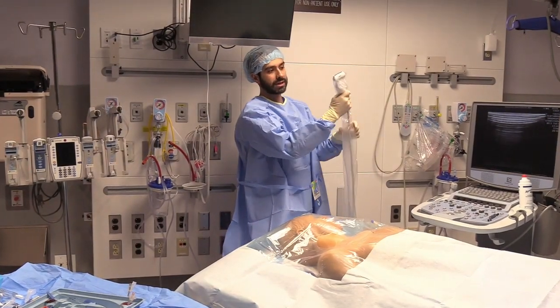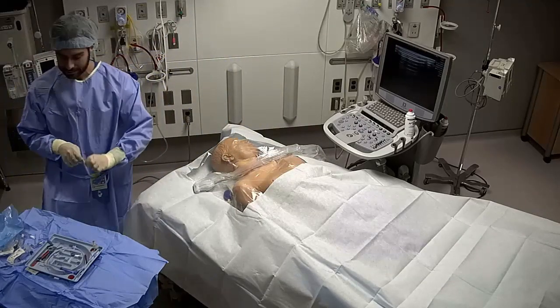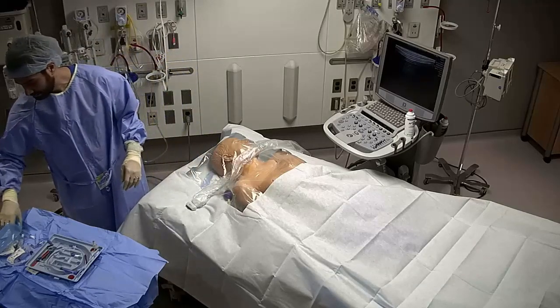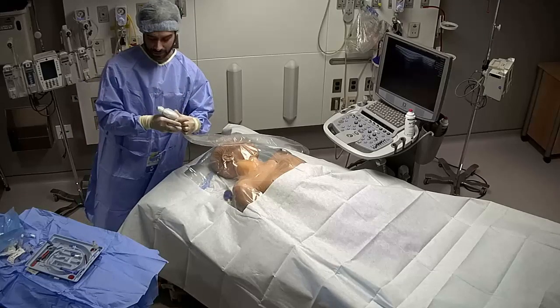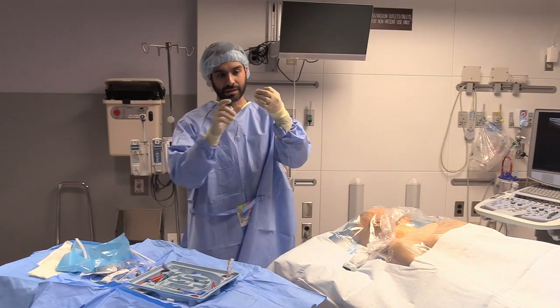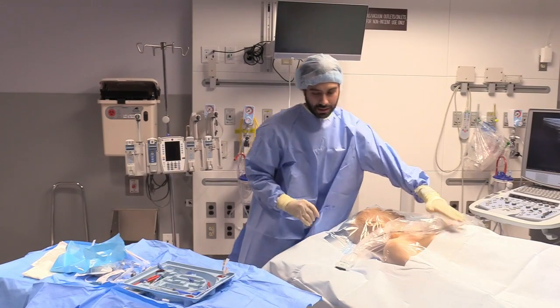Making sure that you have gel at the top is really important. You can leave this opposite, and then grab your rubber bands to keep the gel in place. Everybody does this a little bit different. I like to tape it just in case the patient moves or there's unexpected movements. So this is the tape that comes with the kit, and then I'll tape it across their chest, making sure I have enough laxity to be able to use the ultrasound probe. And we're ready to go.